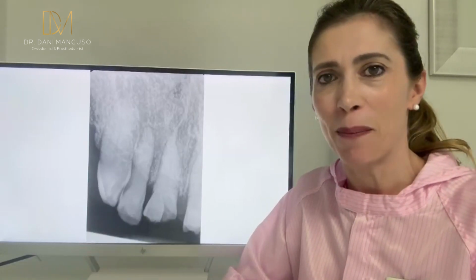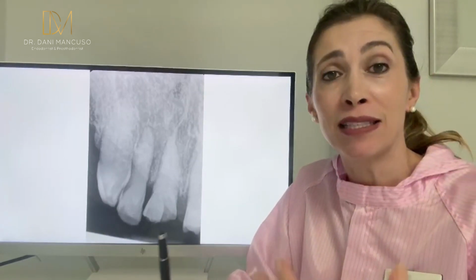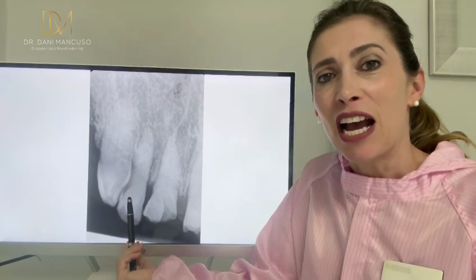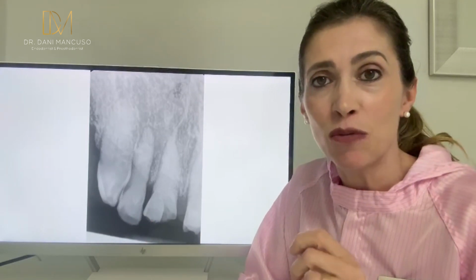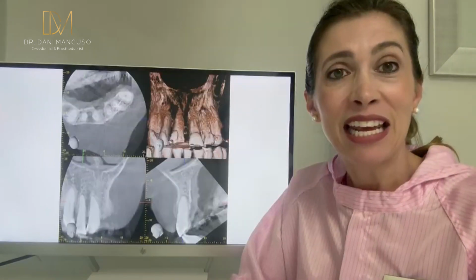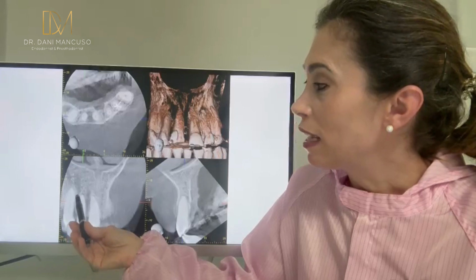You know that I love incisors because when you think they are easy, they can be quite tricky. And this is one of them. So the patient had a trauma, fractured some teeth, as you can see. There is a calcified canal on this lateral. The lateral presents with mobility grade 2. And if you check the CBCT, there are radicular and apical radiolucencies on that tooth.